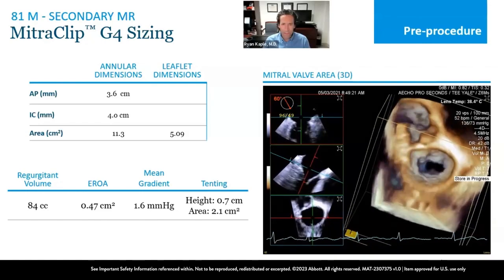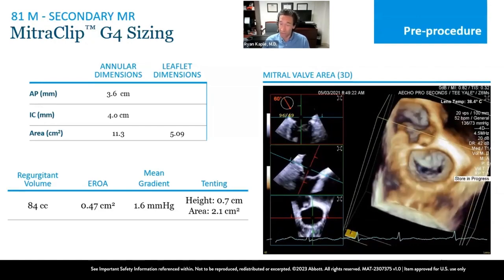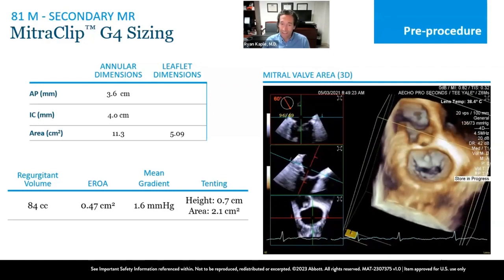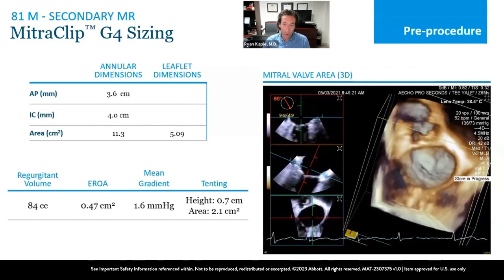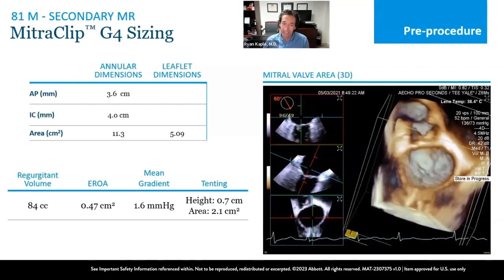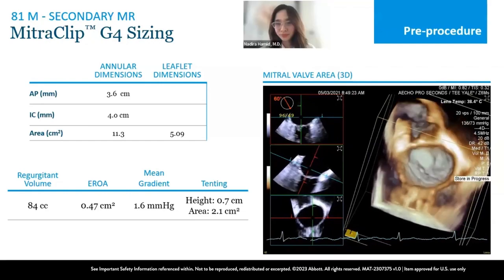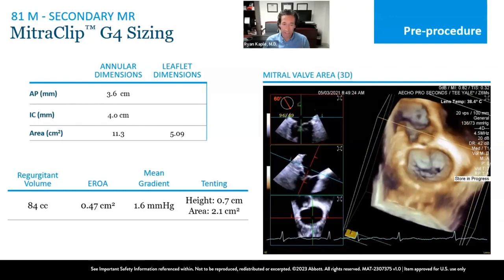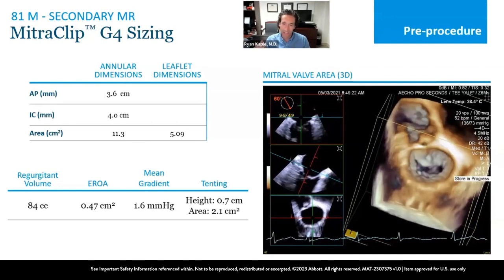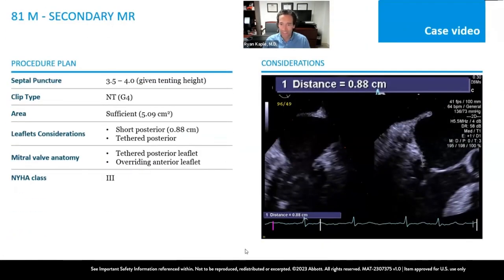Yeah, definitely on the dilated annuli that don't have much tent. Those are the left atrial myopathies. Those are really challenging, because you're asking a lot of the leaflet in terms of restoring that coaptation zone. And so when we talk about tent, when we make that transseptal, we're measuring the puncture site to the annulus usually. But when it's a secondary MR case, the tips of the leaflets may be coapting below the level of the annulus. And so it gives you a little bit of latitude, and you can puncture a little bit lower. And I'll demonstrate that as we go through this case.